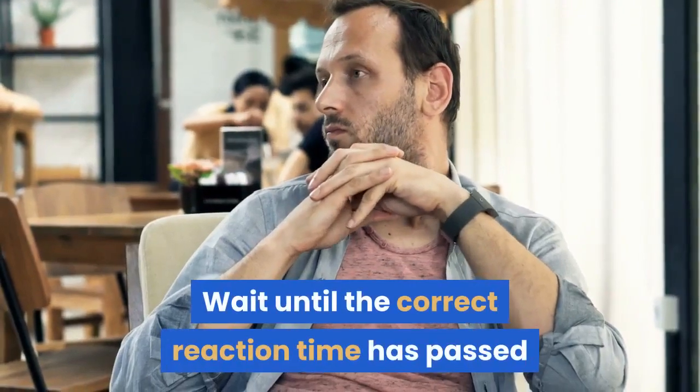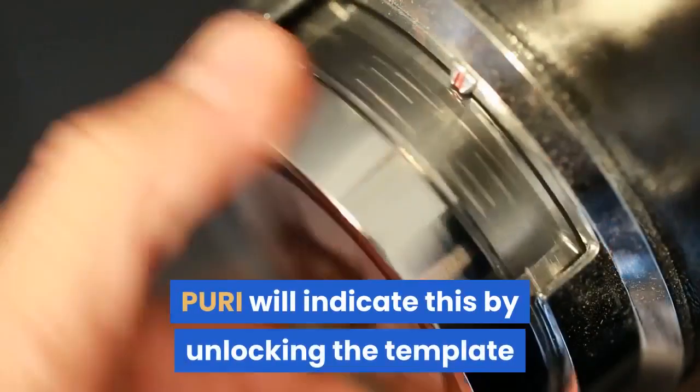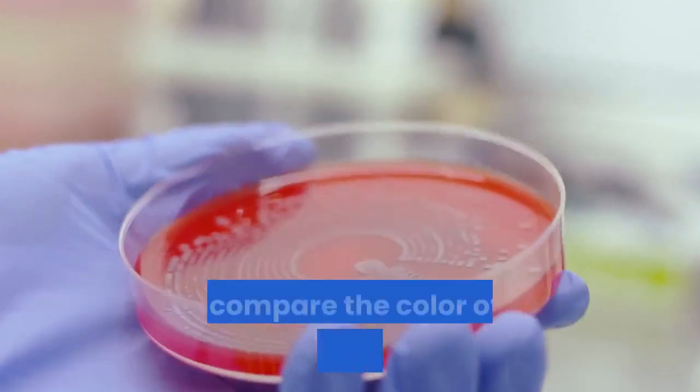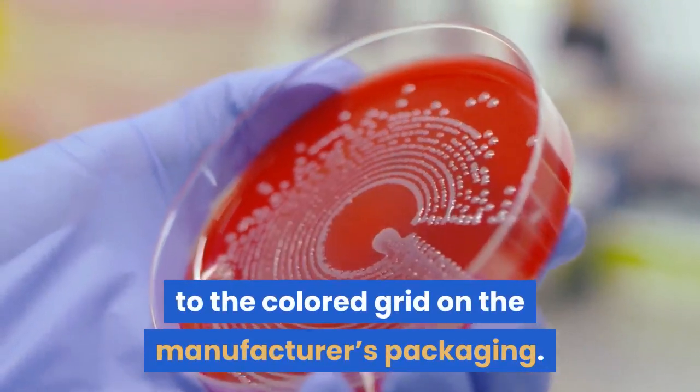Wait until the correct reaction time has passed before reading your strip. Puri will indicate this by unlocking the template so you can enter results. When the reaction time has passed, follow the manufacturer's instructions and compare the color of the reagent pads on the strip to the colored grid on the manufacturer's packaging.